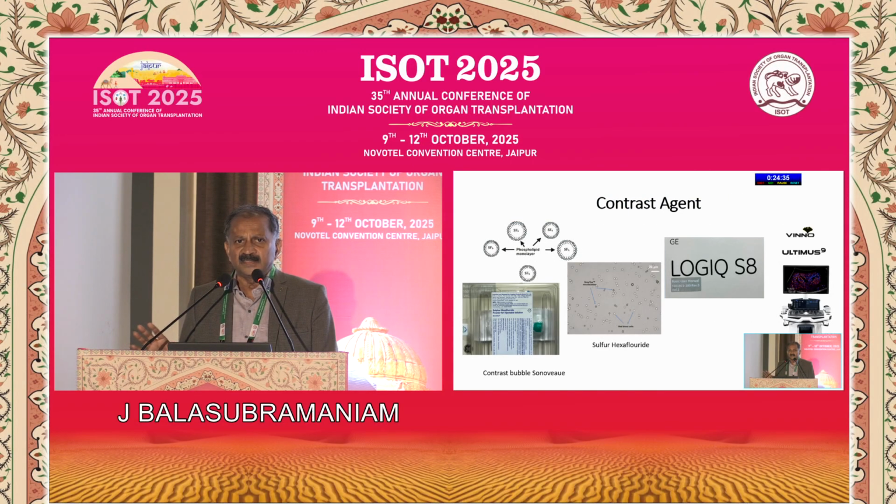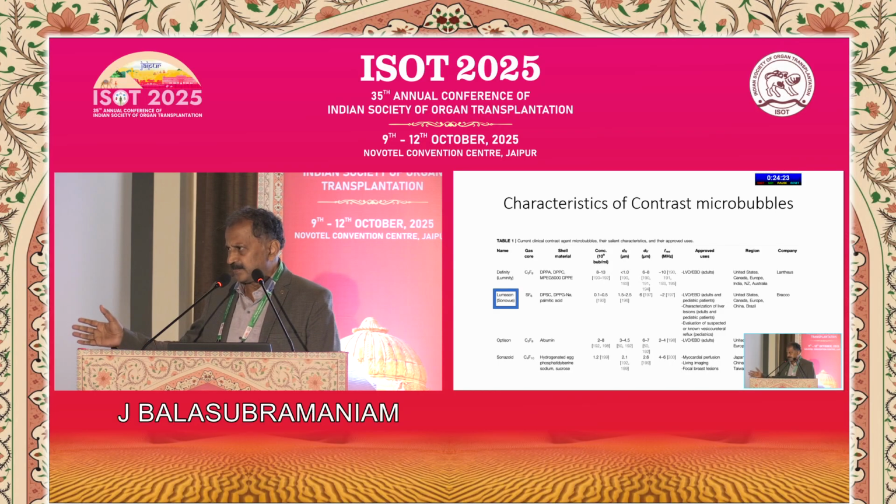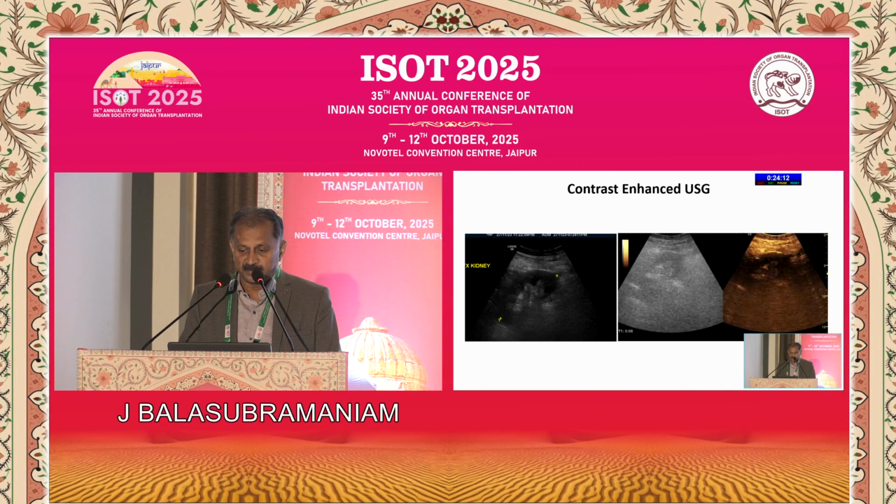And traditionally, they use it for differentiating between benign and malignant tumors and other specialties. But in kidneys and especially transplant, it is underused, I think. Actually, we have an intention to demonstrate this contrast. I hope the machine which is available here will let me demonstrate it well.